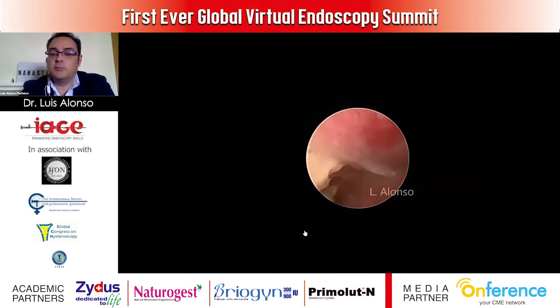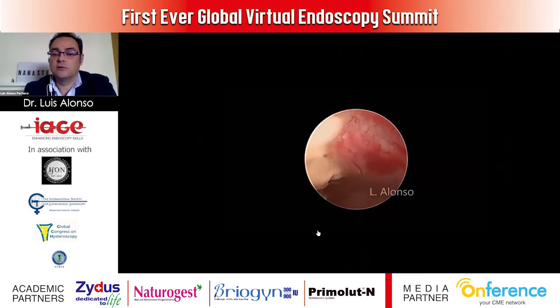And look at this small video, and you can see the arteriovenous malformation. Okay, if we touch this with our curette, we can have big problems.